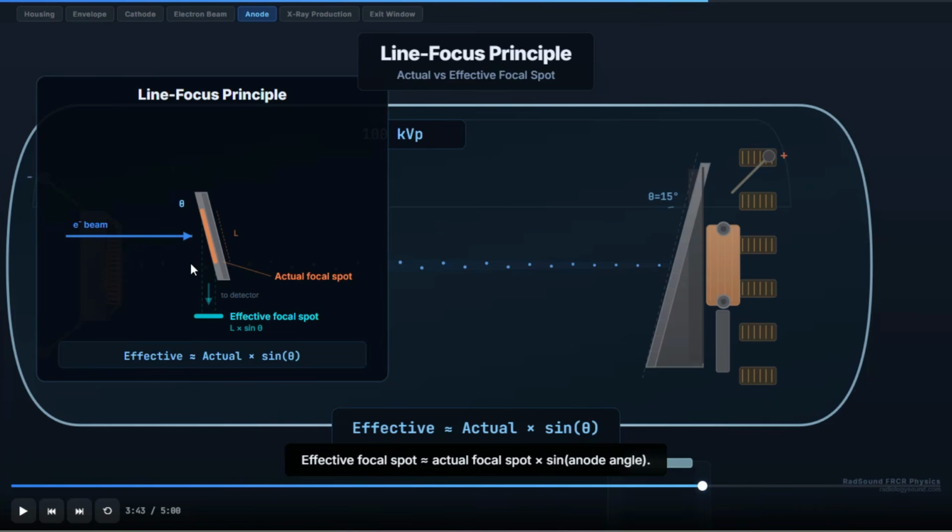They become more attenuated. That is important, because in radiology we place the thicker part of the body toward the cathode, because the higher intensity energy can travel with less attenuation and allow better imaging.